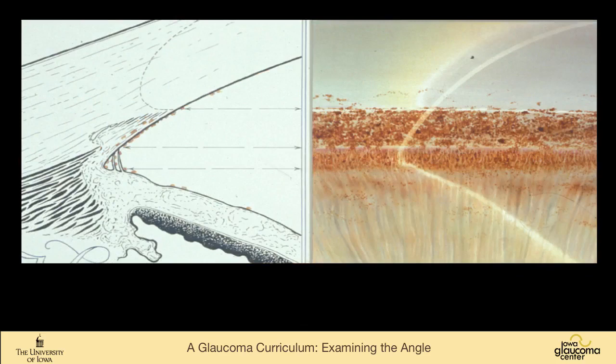This patient has a deeper insertion. One can see that it inserts into the ciliary body face. Here's scleral spur, a lot of pigment here. So this is a D because it inserts into the ciliary body face. 50 degrees. Again, this is flat, 4+ pigmentation. D50F4.